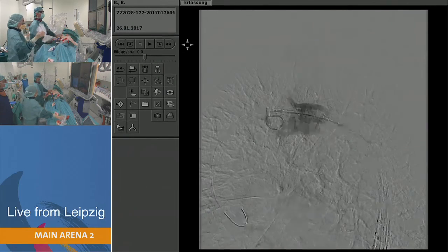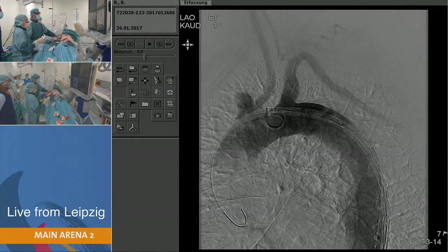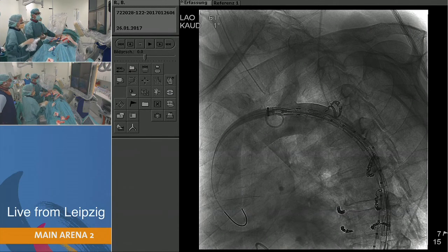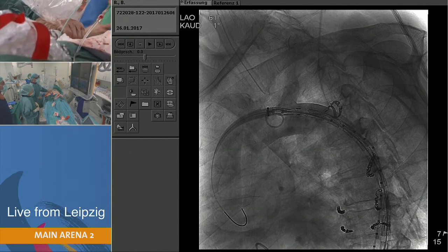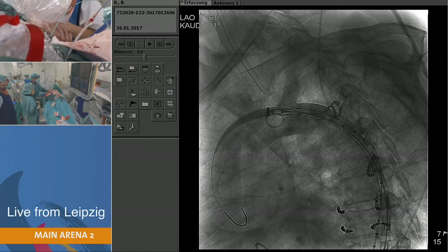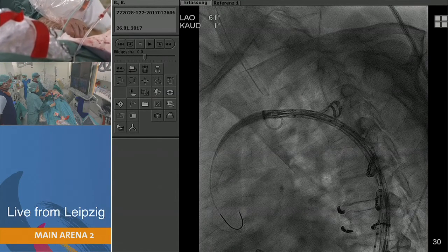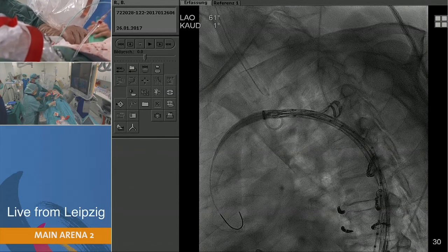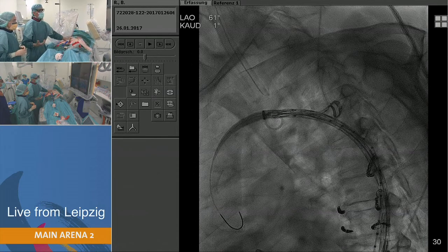What guidewire are you using? This is a Lunderquist wire, 260 centimeters long. I think this is a very good position. We have a little bit of a landing zone here to the subclavian artery — the first entry tear is actually a little further down, so this should be an excellent position. The neck length before the entry tear is in fact three centimeters. There is already some intramural hematoma reaching up to but not around the subclavian artery, so I think this is a very good position.